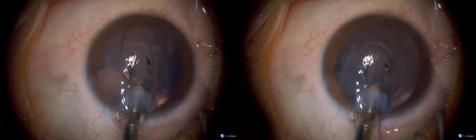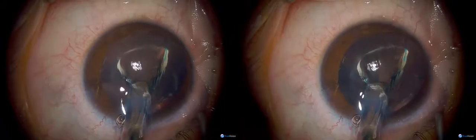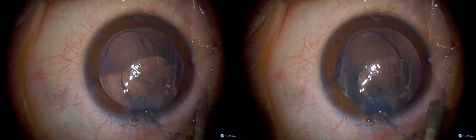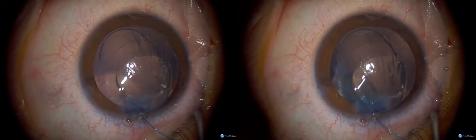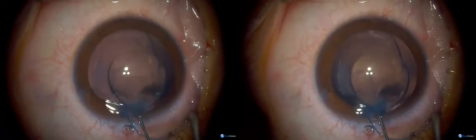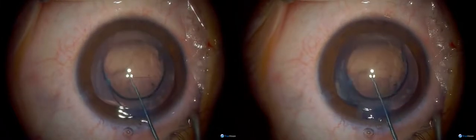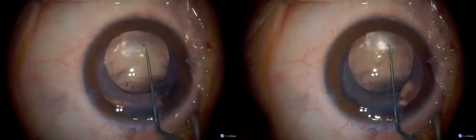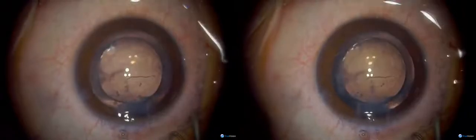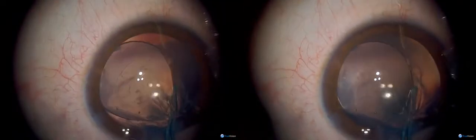It's turning the wrong way — okay, the leg needs flipping over. And then I'll have the rhexis forceps please. This is a little bit tricky because you've got to go under the lens to extend that rhexis.